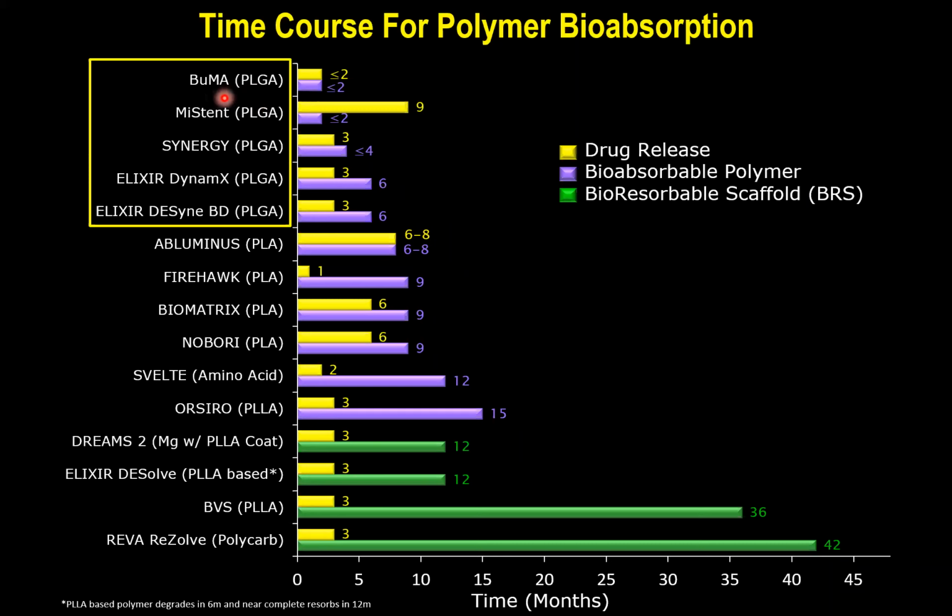Alexandra Lansky was co-PI in North America for this trial, and was first author on the pivotal Pioneer 3 IDE trial publication. Synergy has an 85-15 LG ratio, with polymer absorption over 3 to 4 months. We're going to touch on Elixir DynamX. I hope you'll see this in an IDE trial in '22. It's an 85-15, but it comes out to 6 months because it's really a bilayer with PLLA. We're going to see this in a minute.